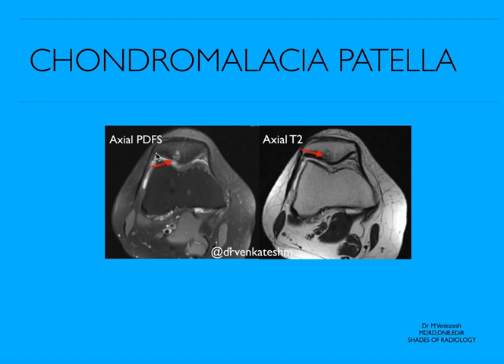You can see this is the lateral patella facet, then this is the medial patella facet, and this is the median ridge of patella. This is the normal cartilage — you can see the outline — and here you can see there is a cartilage defect and multiple subchondral cystic changes and some amount of sclerosis.